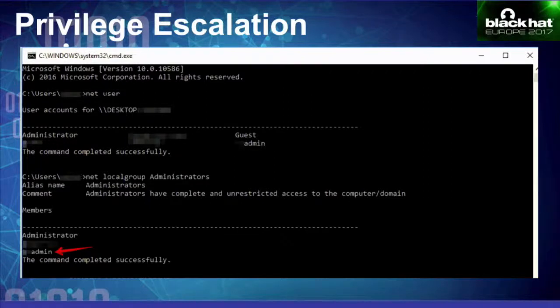So we could explore more of the operating system, look at more files, and more importantly, install tools that we wanted to. First of all, we installed Wireshark. We started to explore network traffic and spent a few hours analyzing that, but there wasn't much in there because all the data was encrypted.